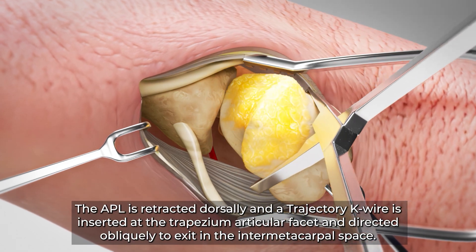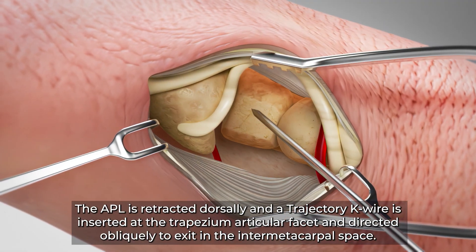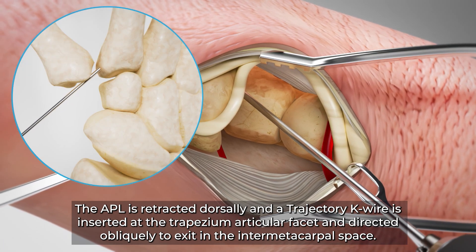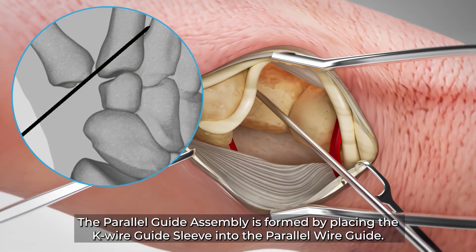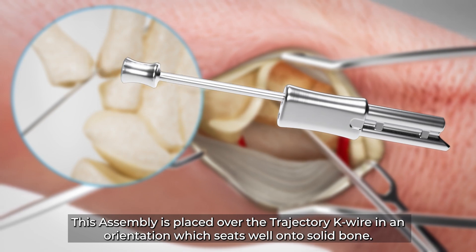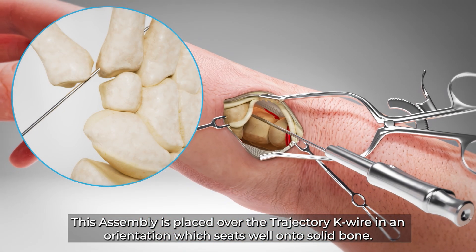The APL is retracted dorsally and a trajectory K wire is inserted at the trapezium articular facet and directed obliquely to exit in the intermetacarpal space. The parallel guide assembly is formed by placing the K wire guide sleeve into the parallel wire guide, and this assembly is placed over the trajectory K wire in an orientation which seats well onto solid bone.